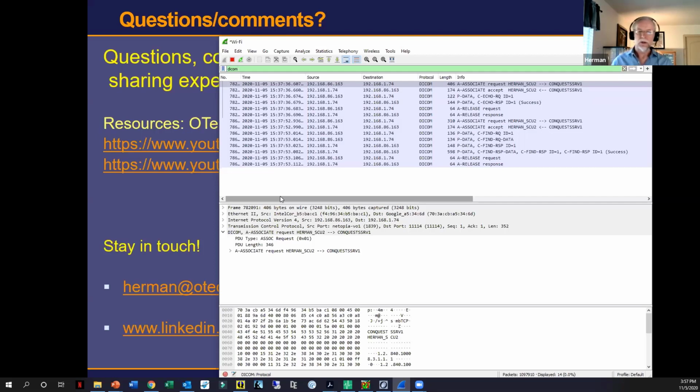If you have a hospital that is run more top down, and the IT department says everybody has to use the radiology modality worklist provider, there's no reason not to, right? But then you need to make sure that the orders go to the radiology modality worklist provider. Make sure that you filter the echo ultrasounds from the radiology ultrasound, so that OBGYN doesn't show up on the cardiology list and stuff like that. So you have to do a little bit more configuring, but I would recommend using a single one. Why would you use two different ones, right? It makes life complex. Use a single ordering system.